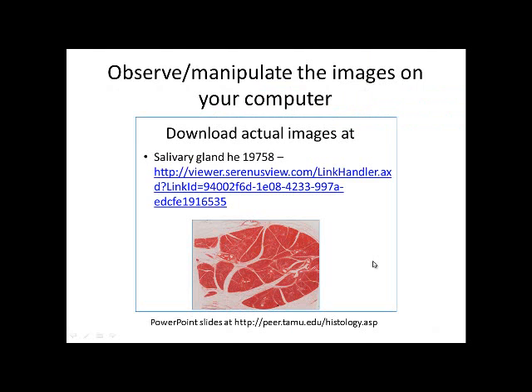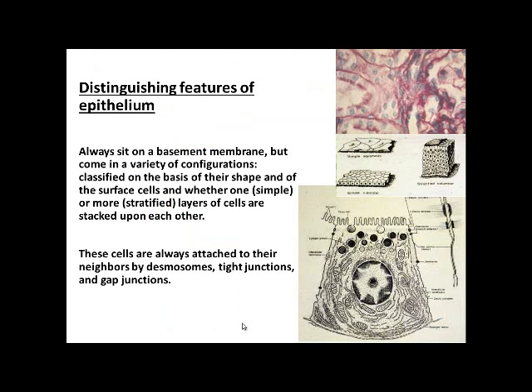Today we want to look at salivary gland, and you'll be able to observe the salivary gland, interact with it, manipulate it, change the magnification, make measurements on the cells if you go to this website, as we'll see there. And you can locate those websites at this website. This website gives you this URL to be able to do that. And also the PowerPoint slides can be seen on YouTube where it says to see PowerPoint slides.